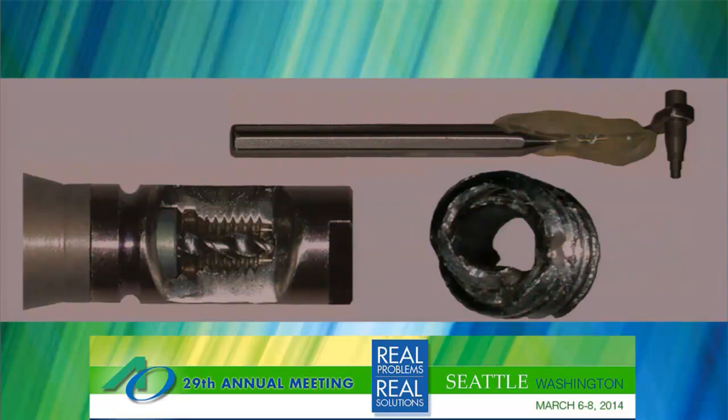This is a blow-up of the guide and the drill. This happens to be a 31 thousandths drill. And that drill is capable of going down through the center body of the screw if used correctly, right through the middle. It's a Robin Hood shot, if you use archery terms, right in the middle of the target. And was able to pull that screw fragment out without problem.